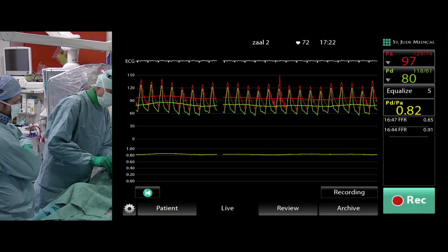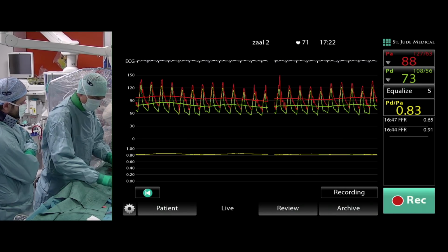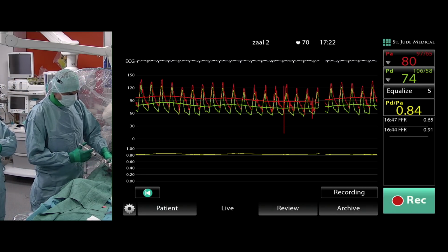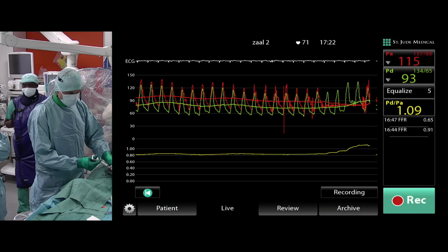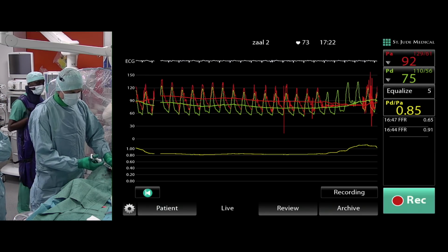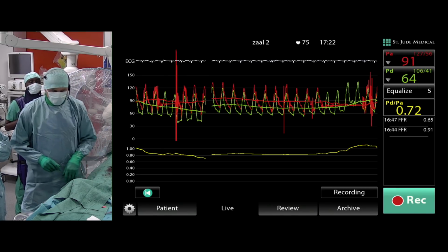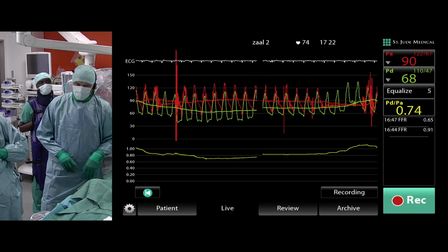Here, may I just ask, is there anything the colleagues should be careful with if they want to induce hyperemia with papaverine? Yes, there is one detail. You are absolutely right, Gabor. There is one detail, and this is what I'm taking care of right now, is to flush the whole system with saline. So I flushed it with saline, and look what happened with the pressures. They go down again.